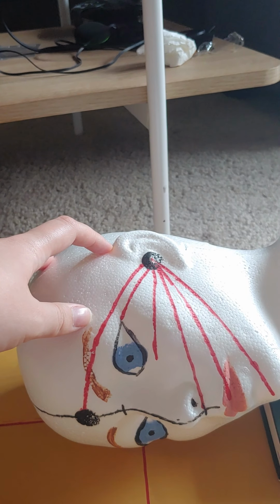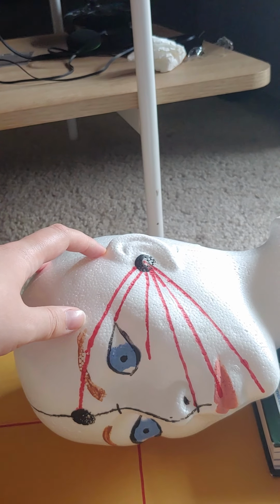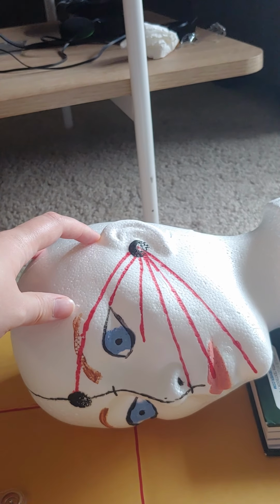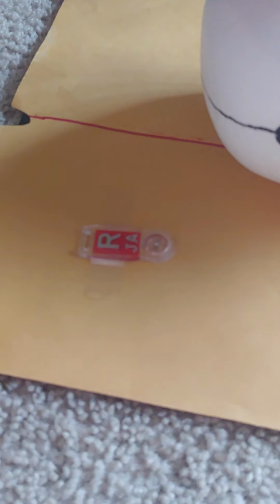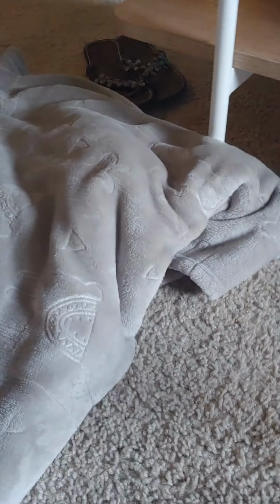The criteria is still the same, with the no rotation indicated by the greater sphenoid wings and no tilt indicated by the orbital plates superimposed. I still have a right marker to show that this is the side that was closest to the IR, and my patient is still shielded.